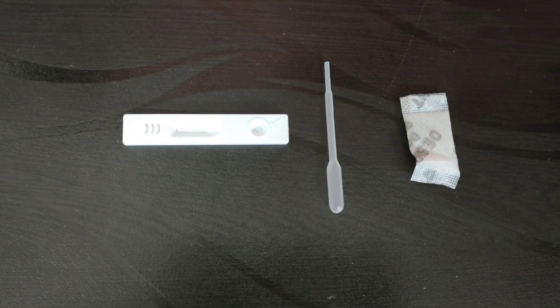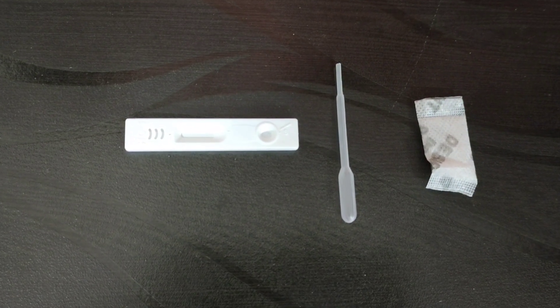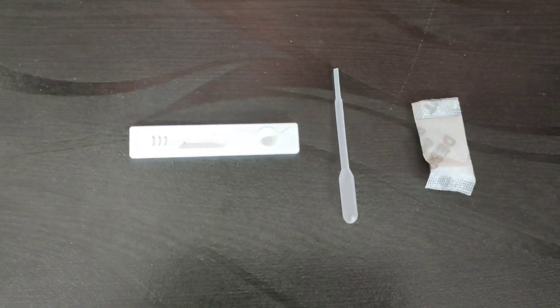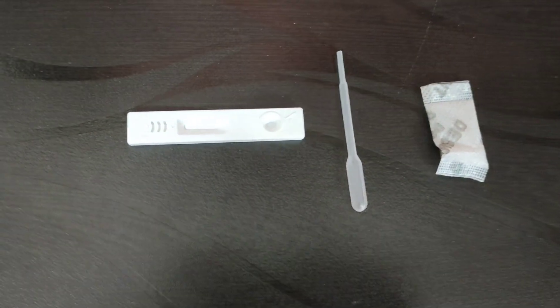Hello everyone, this is Dr. Abhinaya Vijay Kumar. I am a doctor and a Motherhood Empowerment Coach. Today in this video, we are going to perform a urine pregnancy test kit at home.